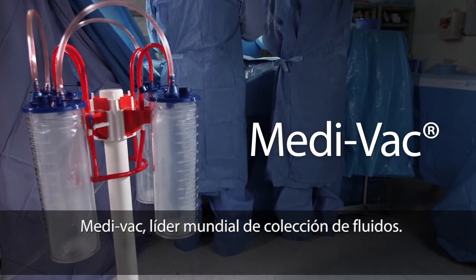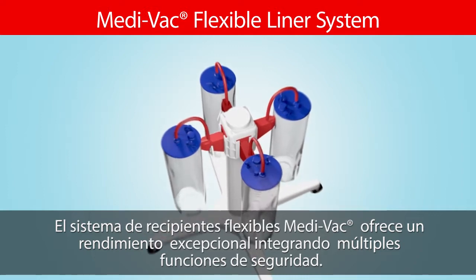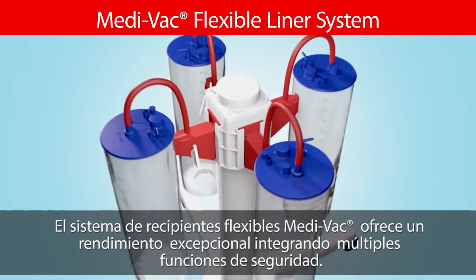Medivac, a global leader in fluid management. The Medivac flexible liner system delivers exceptional performance with a suite of built-in safety features.